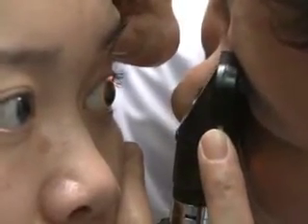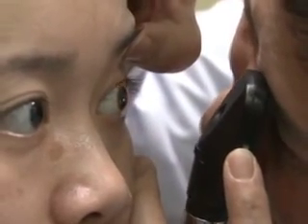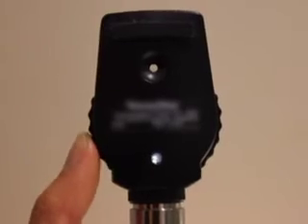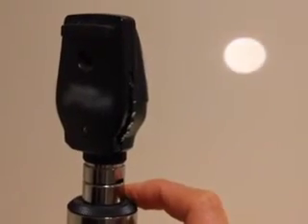Although the fundoscopic examination is challenging for beginners, it becomes easier with practice. Take time to familiarize yourself with the ophthalmoscope before examining patients. Dim the room lights to maximize the dilation of the pupils and improve visual contrast of the fundus. Remember to first elicit the red reflex, as the red reflex indicates successful illumination of the retina.